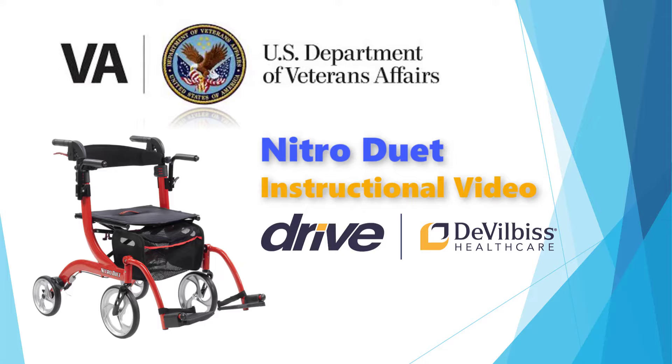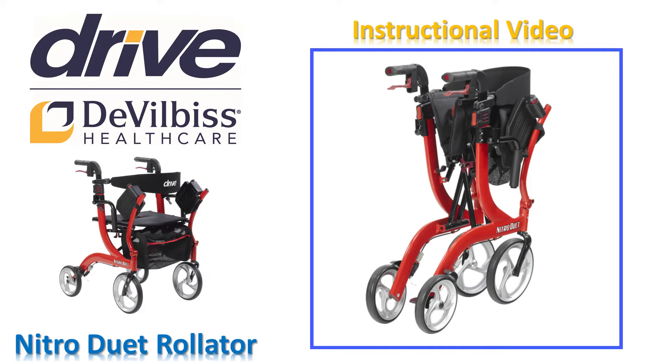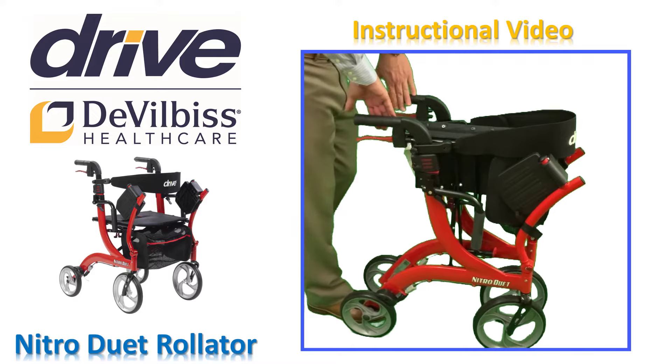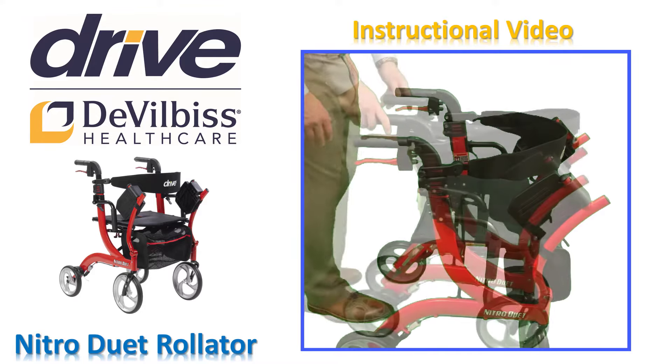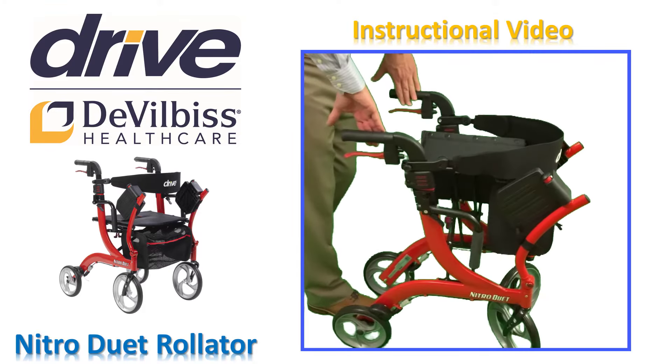Let's begin with a short instructional video to help get you started. Your Nitro Duet Rollator will stand on its own when collapsed with its special side-to-side folding. This will save you space in your home or in a waiting room when you are not using your rollator. To open the Nitro Duet, simply push the handles out from each other until the seat becomes flat. Always be sure to lock the rollator open by pushing down on the seat until you hear an audible click.